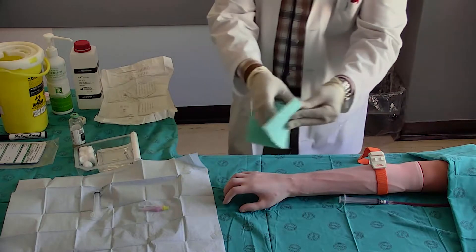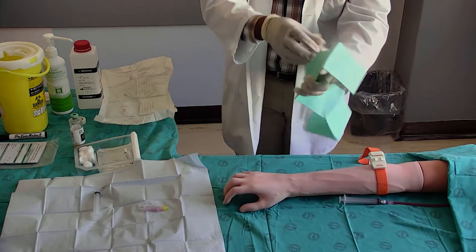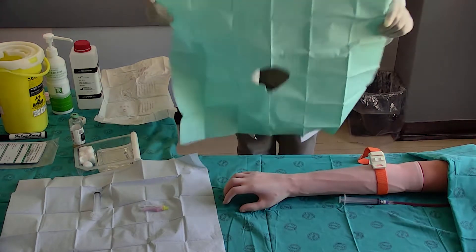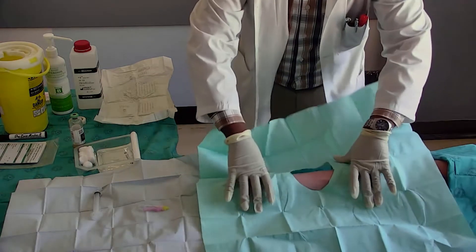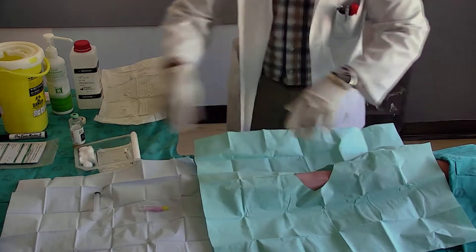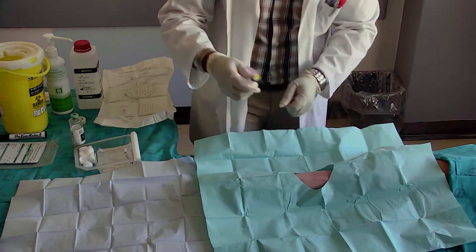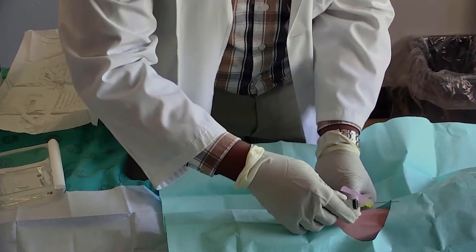Place the sterile sheet with its opening over the venipuncture site. Attach the needle to the syringe and remove the safety needle cap. Place your non-dominant hand to anchor the patient's arm below or above the venipuncture site. This is an important safety measure.